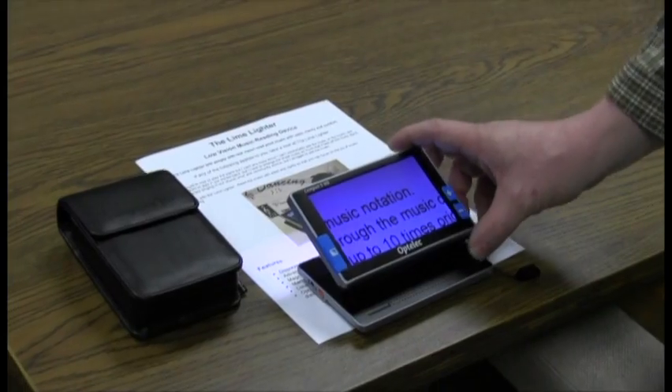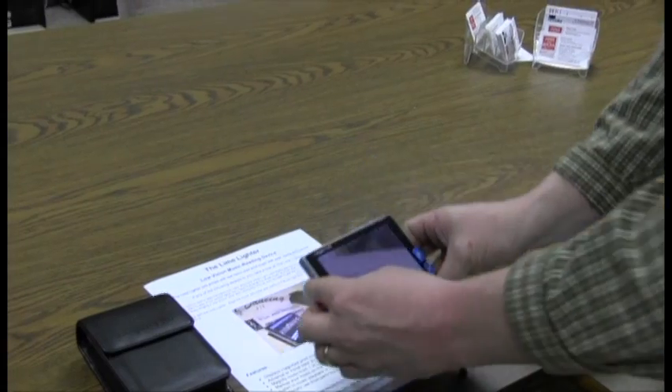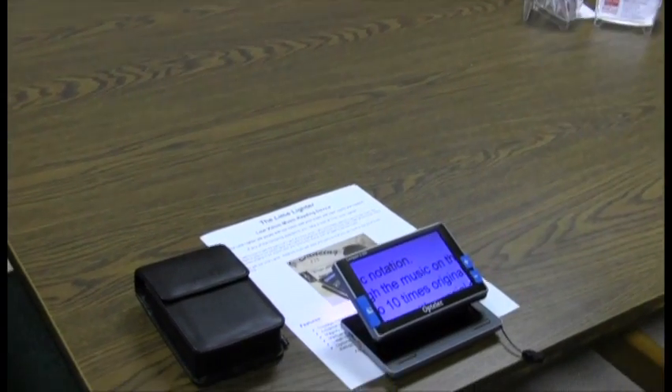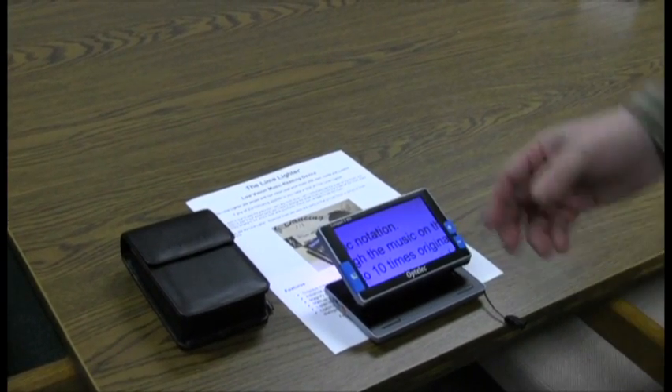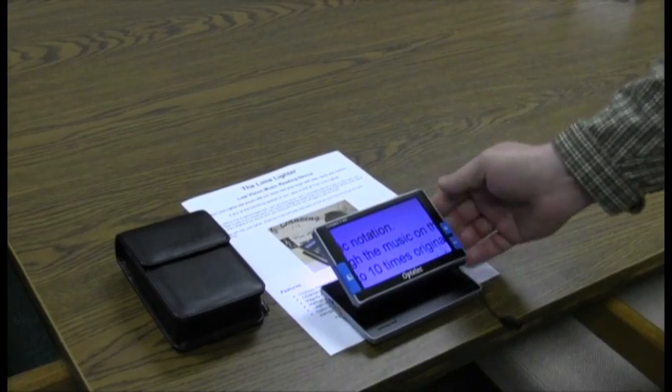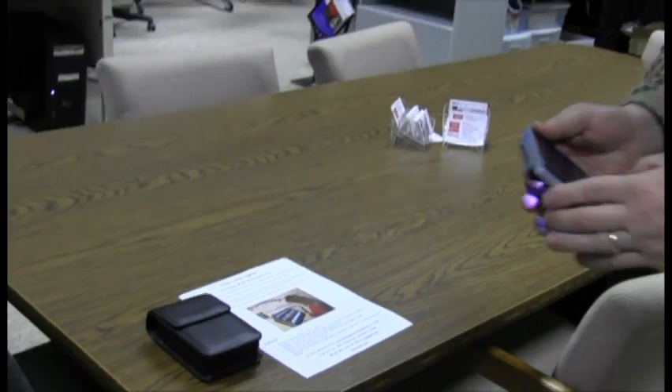You also have a button on the very top — I'll flip that around so you guys can see it. This button up here is your freeze frame, which allows you to take a picture of something that you're looking at. So if you press the freeze frame, it's going to take a picture of whatever you're looking at, so then you can take the device, move it around, and be able to view it more comfortably up in front of you.